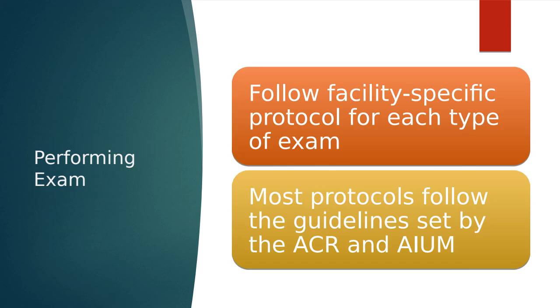So now we're ready to perform our exam, and you have to be aware that we can't just go in and take pictures however we want. We have to follow specific protocols that are usually going to be very similar amongst facilities. So there might be some differences, some kind of minor changes between protocols, but for the most part, the root of our protocols are going to be set by the ACR and the AIUM. So you should remember that from our very first PowerPoint.